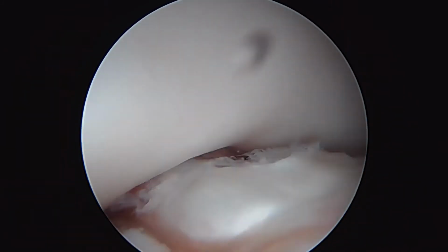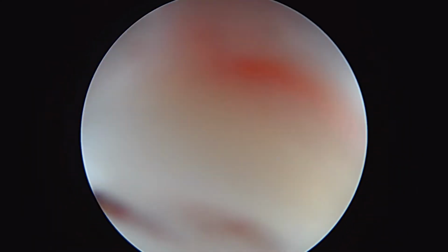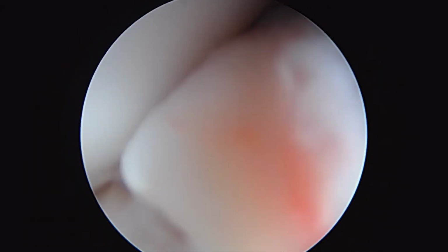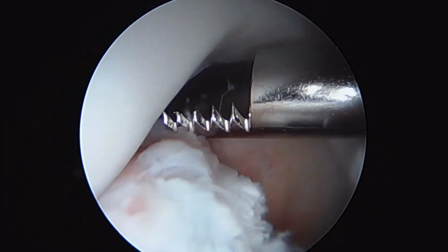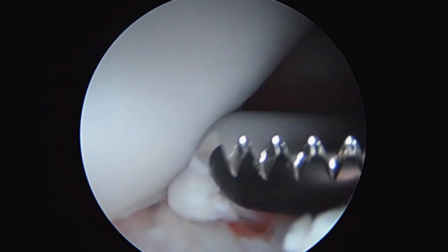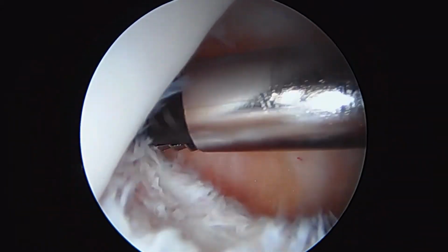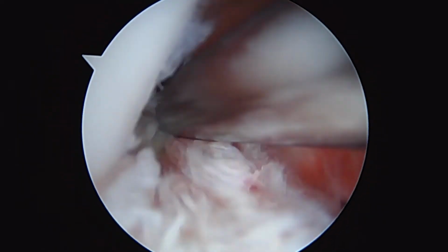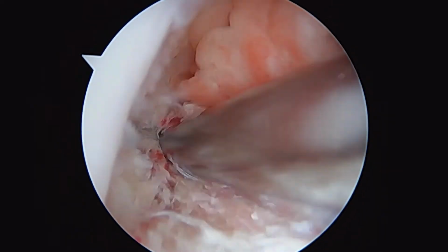We're going to go up on the table, and we're going to get to work on this notch. Put your body up against that for me so the leg stays. And we're going to get to work on cleaning out the old ACL tear, the old torn ligament. And then we'll get to work on reconstructing. But this is all the old torn ligament right here. Okay, so we'll show you some more in just a little bit.